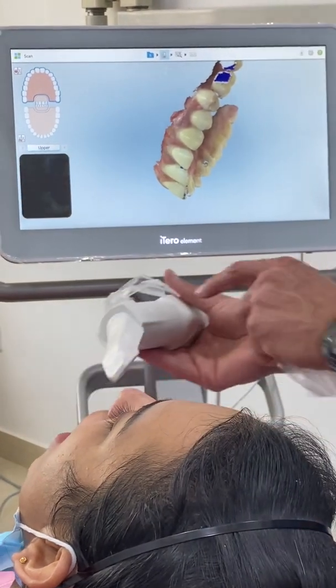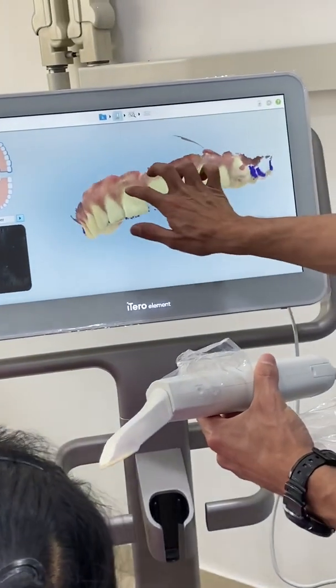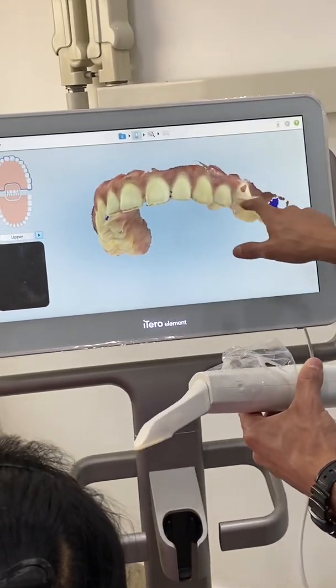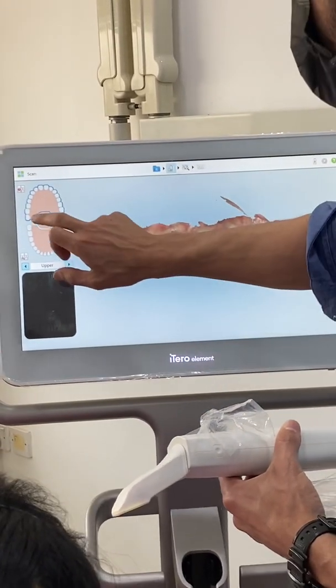So if I push a bit forward, she'll be in real pain. But yeah, you get the idea. It's obvious. The same theory: the blue dots, the major ones you rescan, the small ones you can let go. Now for the bite.